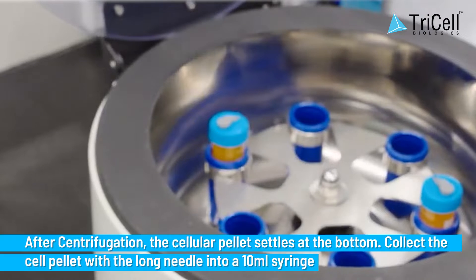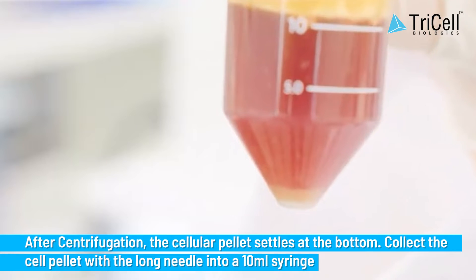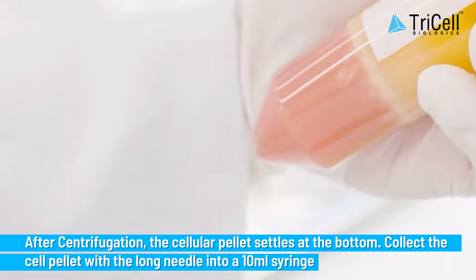Step 8: After centrifugation, the cellular pellet settles at the bottom. Collect the cell pellet with the long needle into a 10 milliliter syringe.